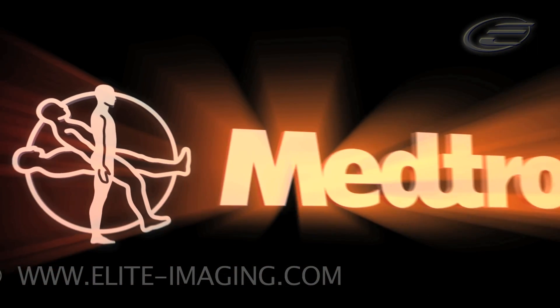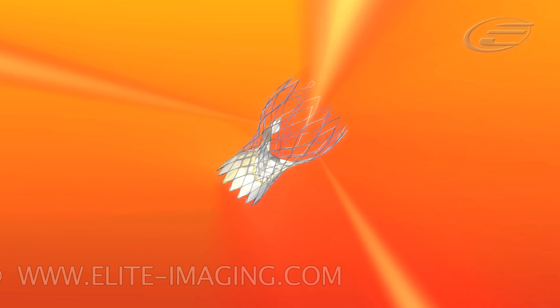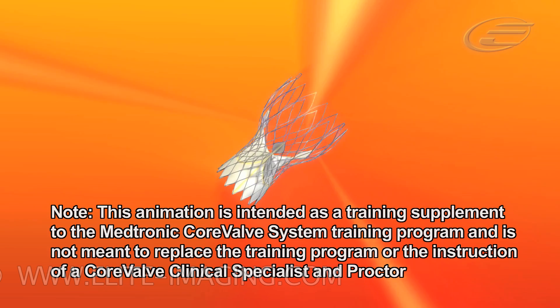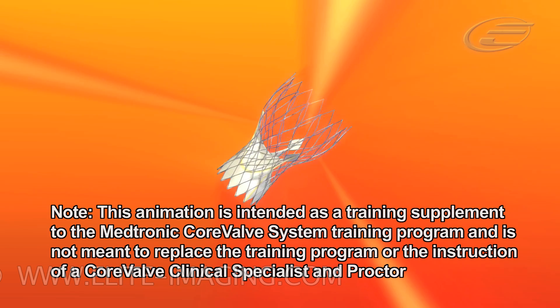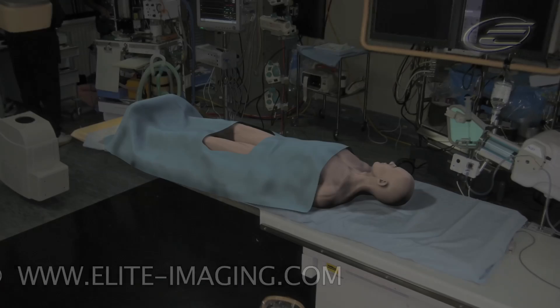This training video illustrates CoreValve's proprietary step deployment procedure for percutaneous aortic valve replacement. The Medtronic CoreValve system is uniquely designed to provide full valve function prior to complete deployment. Note: this animation is intended as a training supplement to the Medtronic CoreValve system training program and is not meant to replace the training program or the instruction of a CoreValve clinical specialist and proctor.